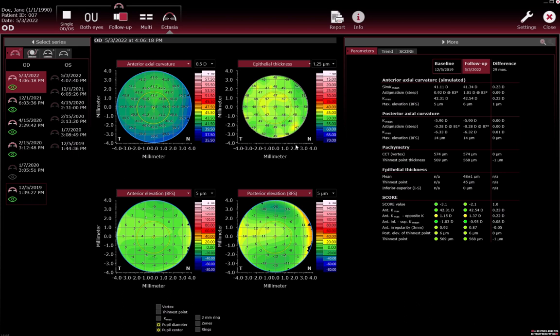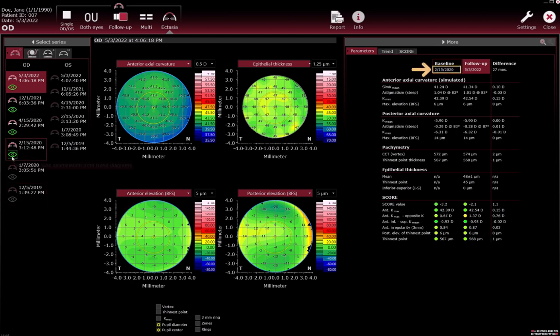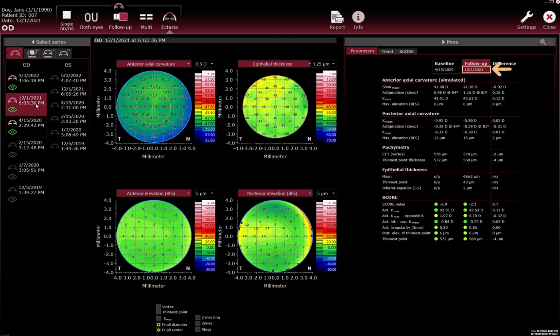Deselect examinations until the examination you want to use as baseline is the oldest of the selected examinations. Click the green eye icons of the relevant examinations to deselect them. To select another follow-up examination, click the date of the examination you want to use as the new follow-up examination. The examination will be highlighted in red.